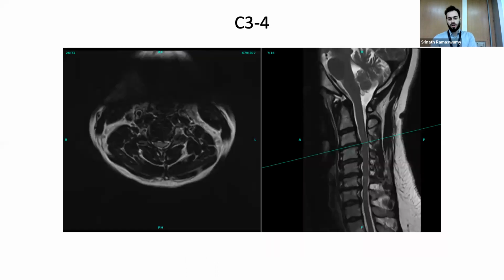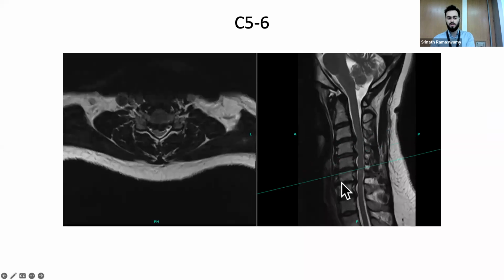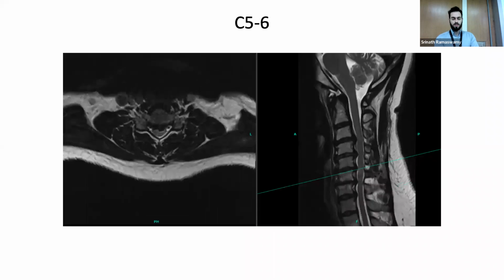If you look at the axial shots, see every level, look where the green is. So this is at C2-3, you barely see any problems there. You shouldn't, unless there's a problem. Here, C3-4, C4-5, C5-6, you can see this black disc or disc osteophyte at this point, and how it's digging into the cord and pushing the cord into the back of the lamina there, at four bad levels. So this is a very tough situation, because this is a physical problem.